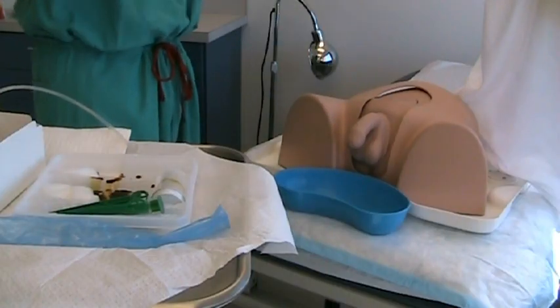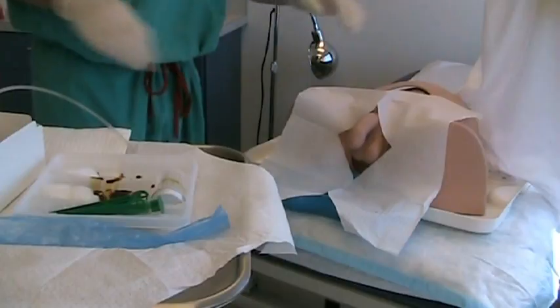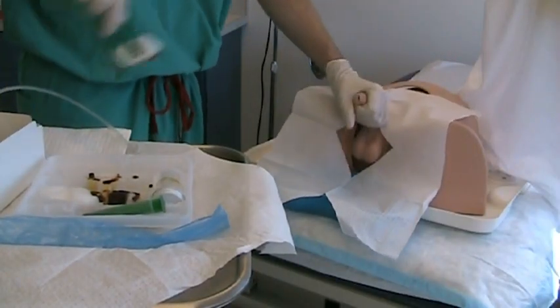The pre-cut drape is placed over the penis. For a right-handed individual, the left hand is used to hold the penis while the right hand performs the procedure.